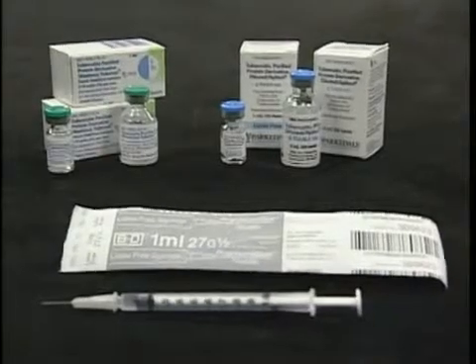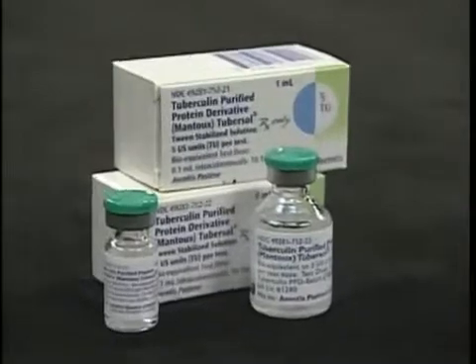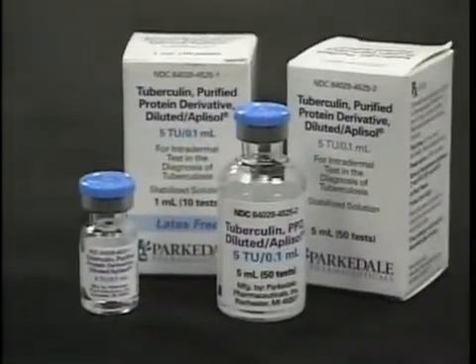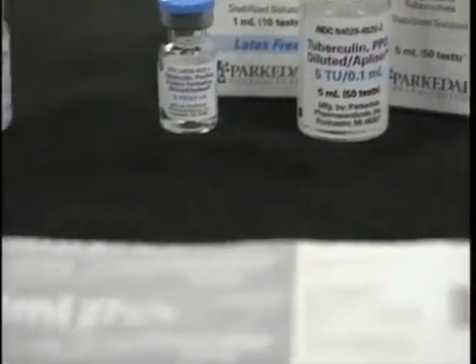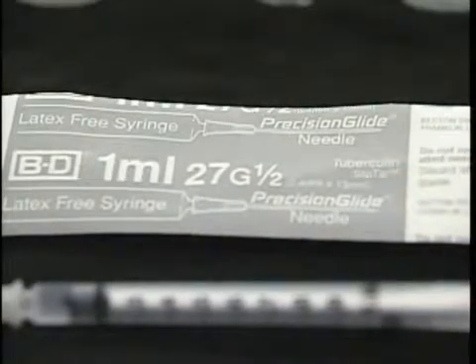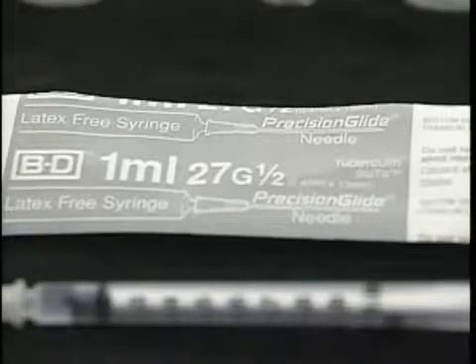Tubersol and Aplisol are the two commercially available tuberculin products. The multi-dose vials contain tuberculin for either 10 or 50 tests. The tuberculin is administered using a single-dose disposable tuberculin syringe that has a 1/4 to 1/2 inch 27-gauge needle with a short bevel.